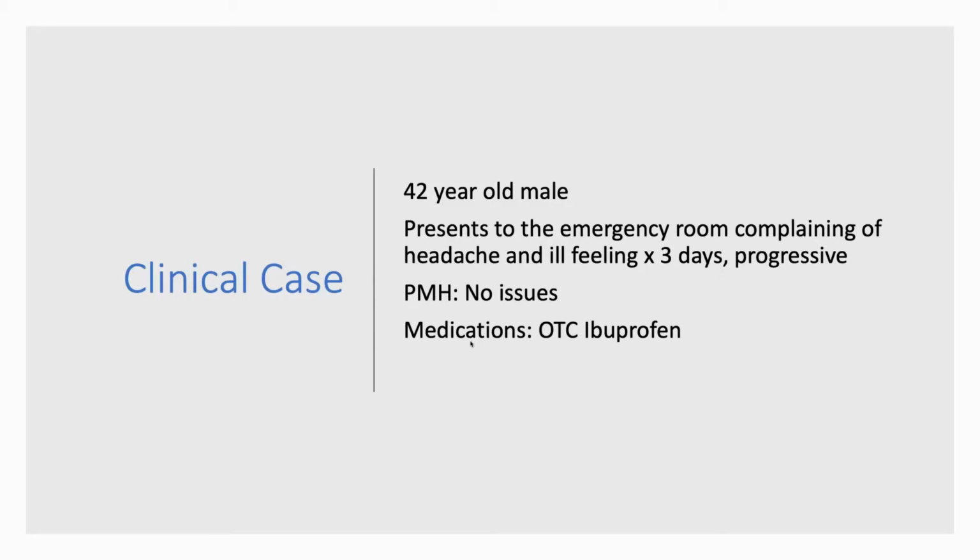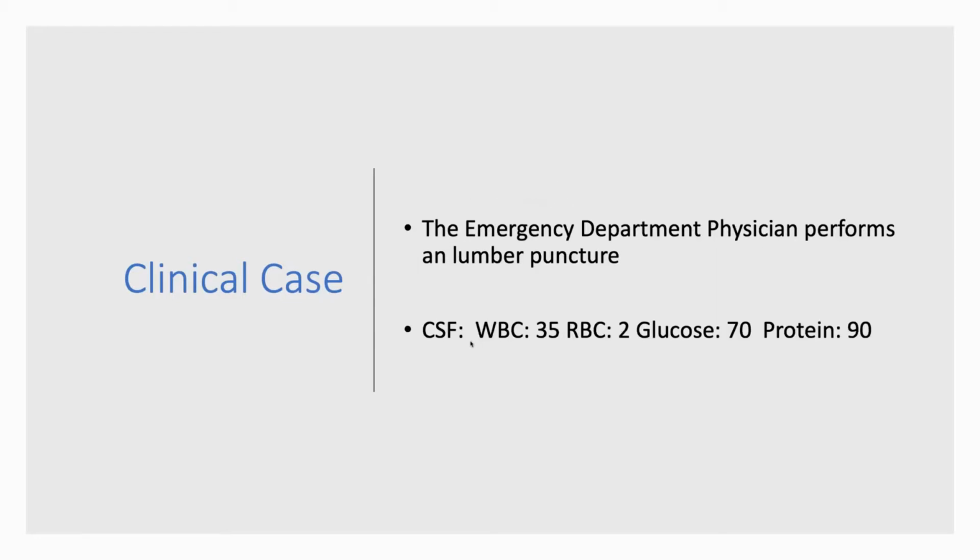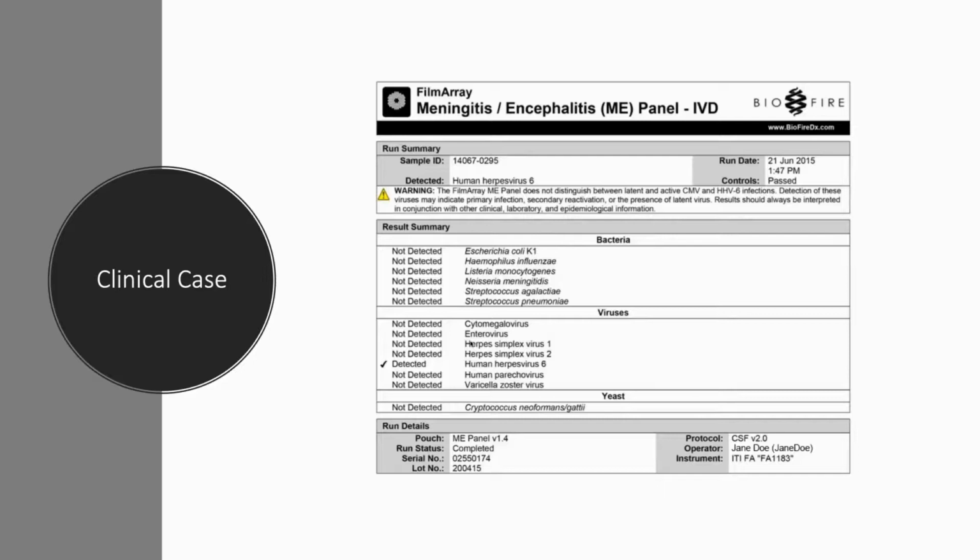Okay. What happened is the emergency room physician said, headache, slight fever, let's do a lumbar puncture. They did a lumbar puncture. Here you see what the CSF showed, and more importantly, the CSF fluid went right down to the lab, ran a BioFire, and it came back human herpes virus 6. Yep, human herpes virus 6. For those clinicians in the group, no, this person's not immunocompromised. There's no reason why this person should be at risk for HHV6.